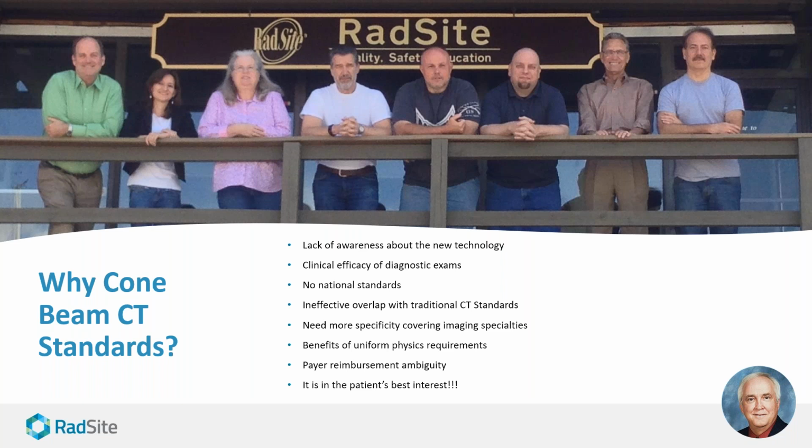And there's no national standards out there really for ConeBeam CT. It's a little different. For traditional medical grade CT, there are standards, but there's some ineffective overlap between what we do with ConeBeam and the traditional medical grade CT standards, even though there are some that overlap each other correctly, but there's some that are not. And we need more specific covering of the imaging specialties. The different types of specialties need different resolutions, different fields of view, which all affect the radiation dose and things that we'll look at a little later.